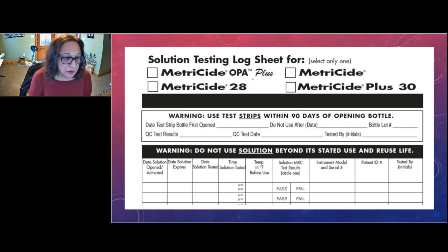If you're doing a specific device that you are soaking, then I would also document that device, the name, the serial number, model number, product number, however you can document that, so that you have proof should something come back at you later.